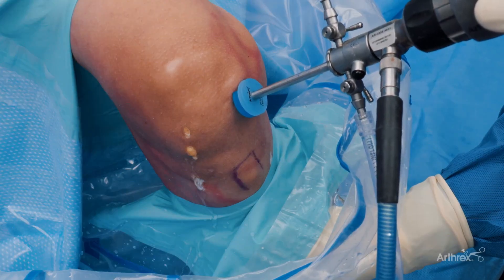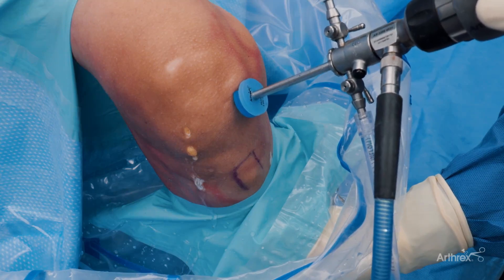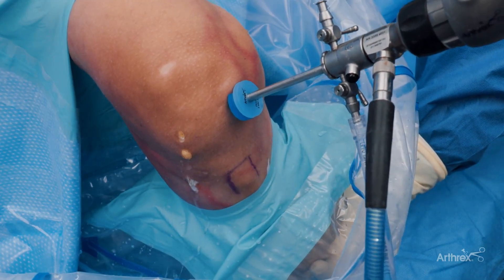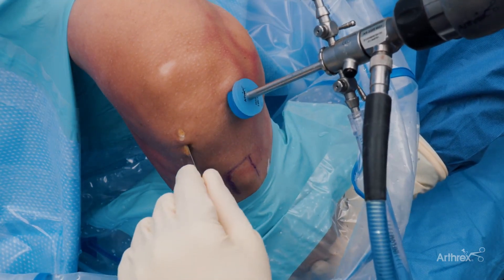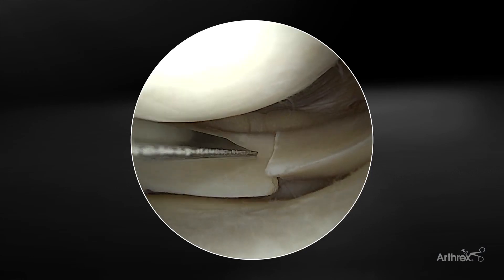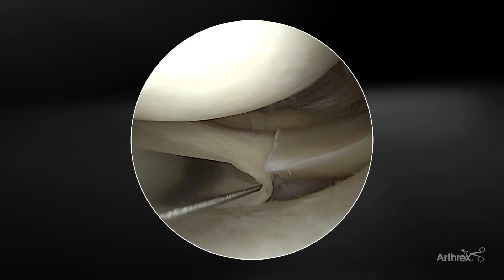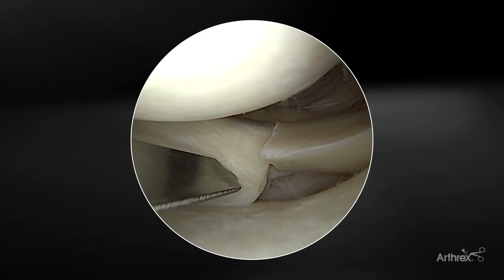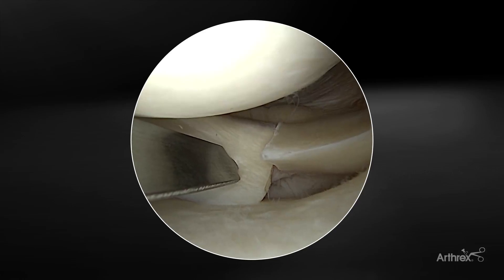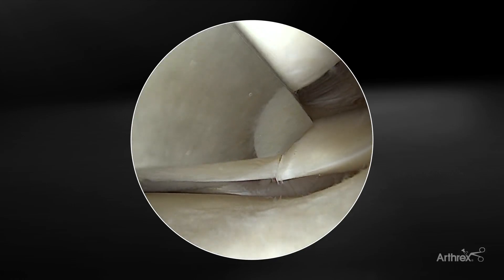We're going to utilize the hashtag suture configuration here. For this configuration, I usually place my ripstop sutures on either side of the radial tear first. Coming in on the ipsilateral side, when you come in with your sled to introduce the implants atraumatically, this is a nice way to confirm your ability to reach all points on the meniscus prior to inserting the implant or deploying one of the limbs.